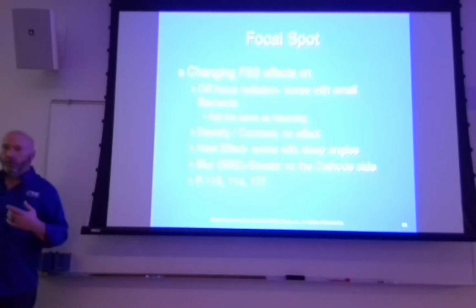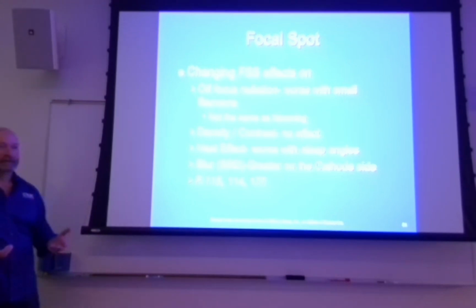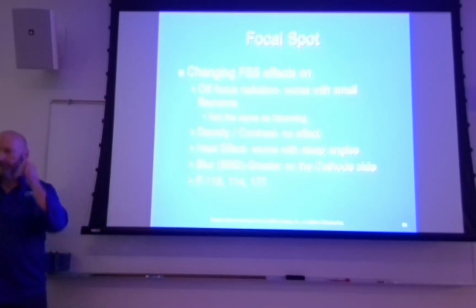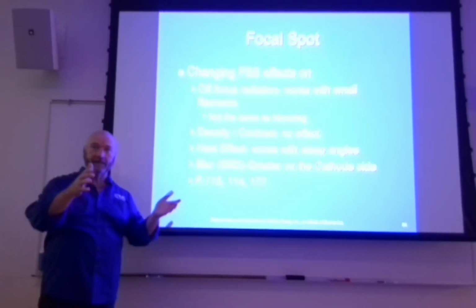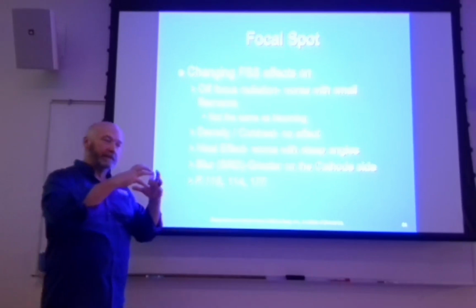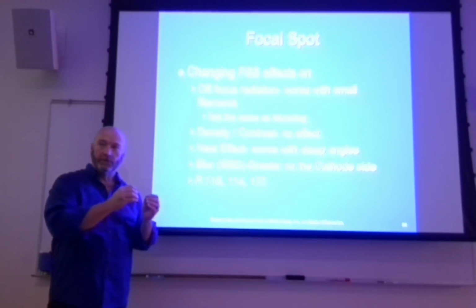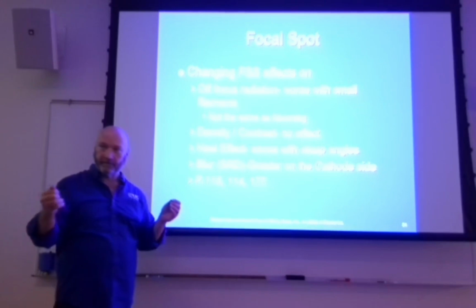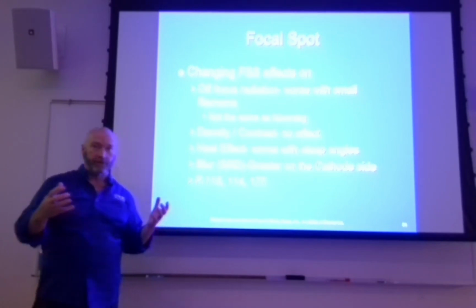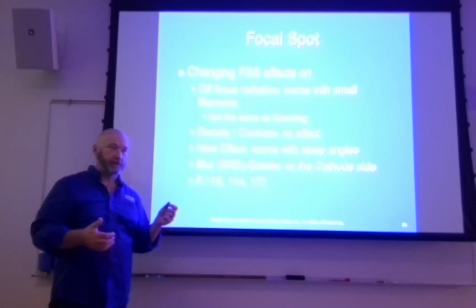So we have two things that we have a tendency to kind of conflate. By the strictest definition, they're kind of the same thing, but we're going to call them something different. If you balloon your space charge and then you send those across the X-ray tube so that the area of bombardment that you intended to use is bigger because you've stood on the rotor button too long, you got a ballooned space charge, then it's creating X-rays that are not on the focal track that you intended to use.